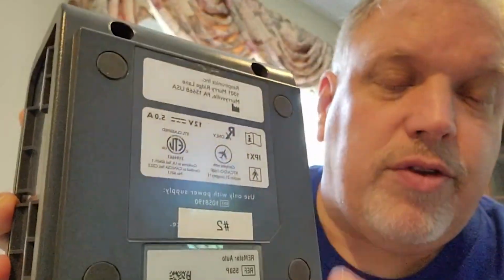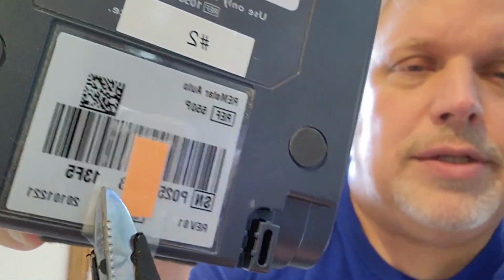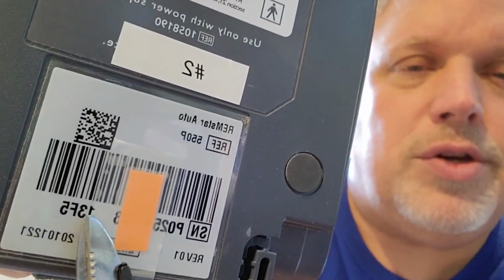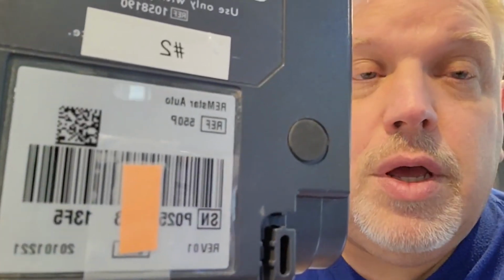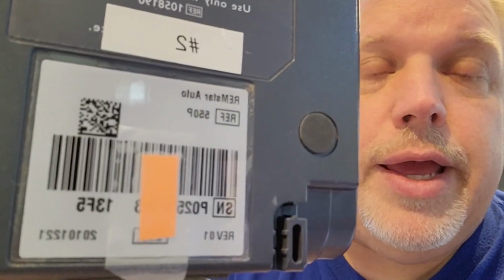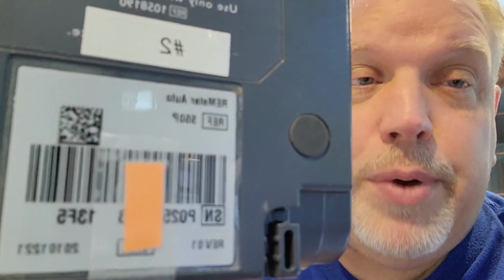This is an A-Flex. I also have a C-Flex. The problem is when I entered in the serial number here, it told me that the unit was not affected by the recall. And the problem is this. If you look at the serial number here, it has the serial number, and then it has a space, and then it has 4 digits. Mine is 13F5. Okay? So with that, what's happening is if you put a space in there in between those numbers, you will not be able to get it set up under the recall. It will not come through. So please make sure when you put it in, do not put any spaces in there.